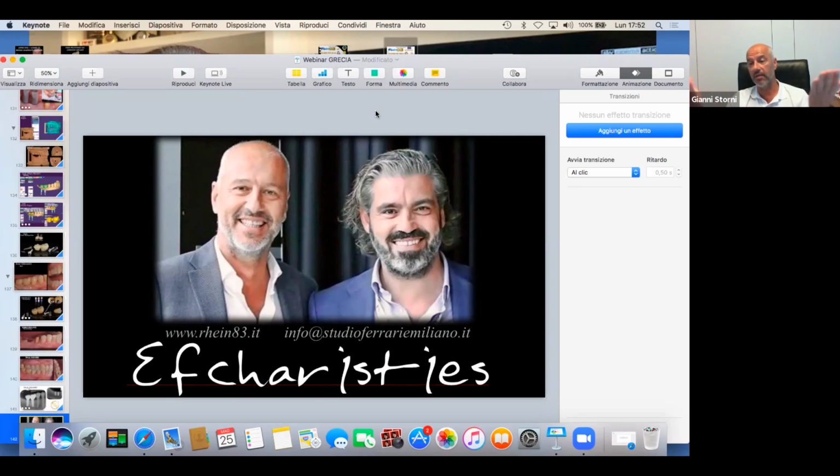Even, as Emiliano told you, the unknown ones, because I'm sure that even there, it is full of tourists, people that are changing the dentist, some all-on-four where one has failed and the patient doesn't know which implant it is. So what to do if you are not able to get the component?